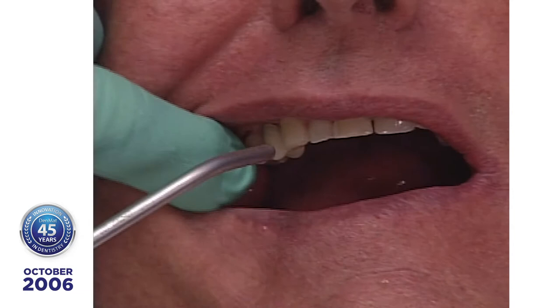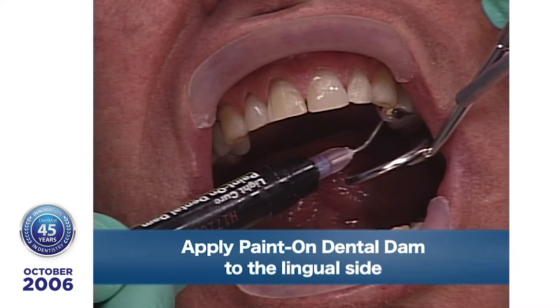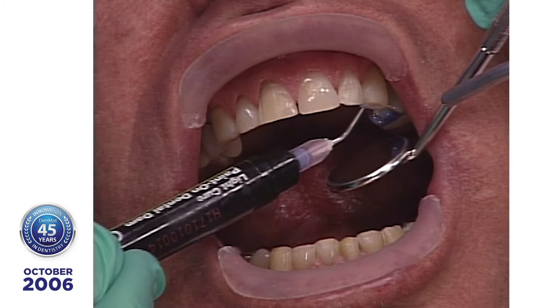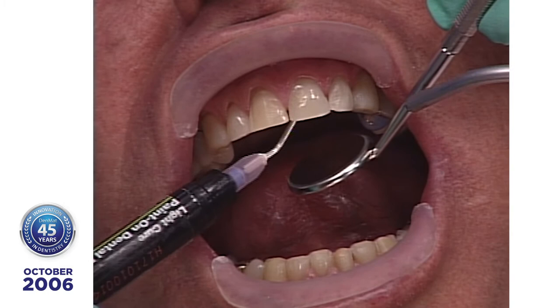Now we're going to put on paint on dental dam on the lingual side. You won't be able to see much while I'm doing this, but I'll give you a peek at it afterwards. All right. And you want to be careful you don't get it going through the interproximal embrasures, or when you put the Lumineers on, sometimes it doesn't seat very well.